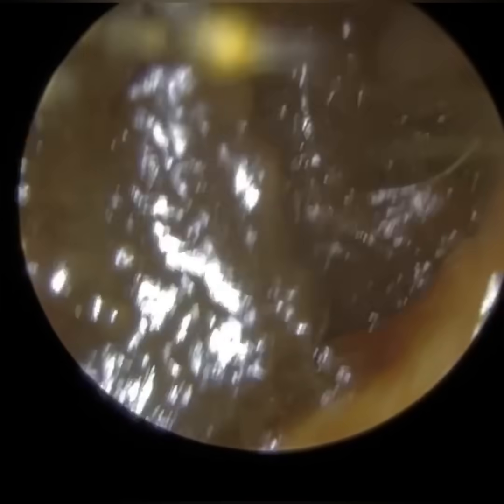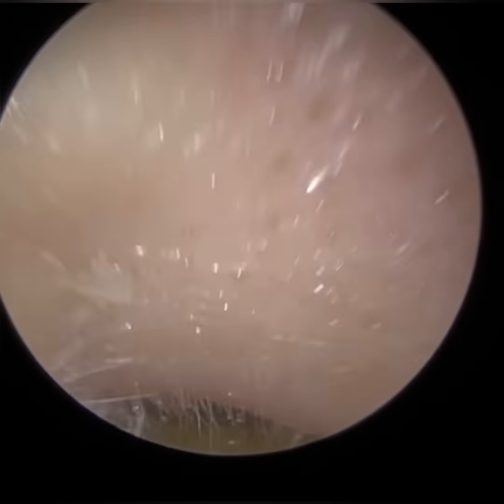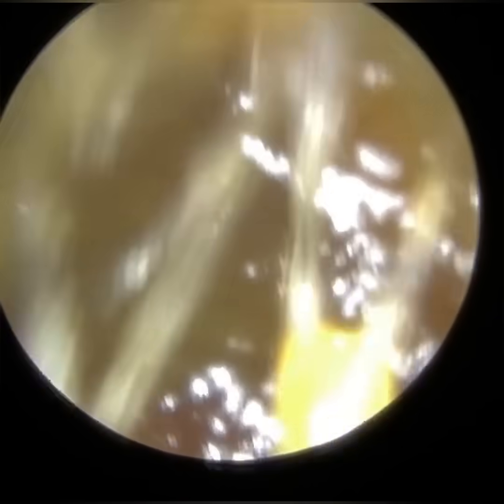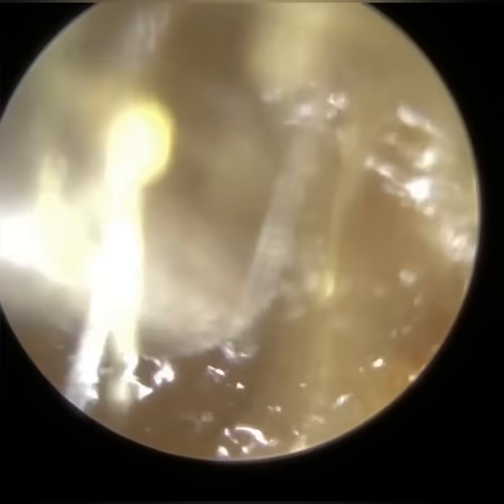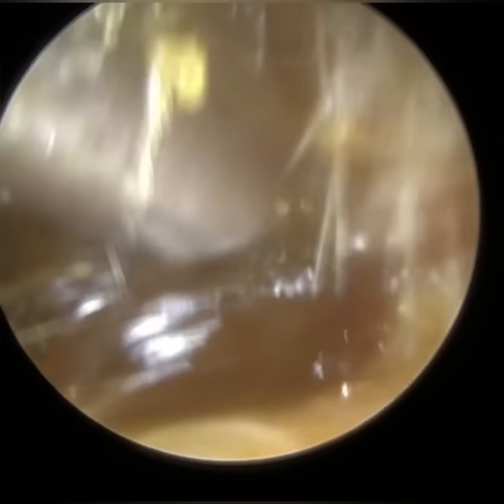We have here a patient who attended with bilateral, fully occluding earwax. We're going to commence with their left ear first. Their wax is quite soft because they've been using some olive oil spray — medical grade olive oil spray — prior to attending.